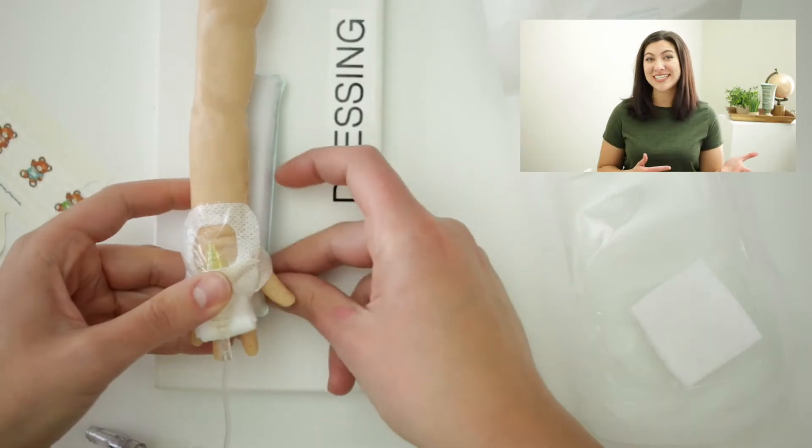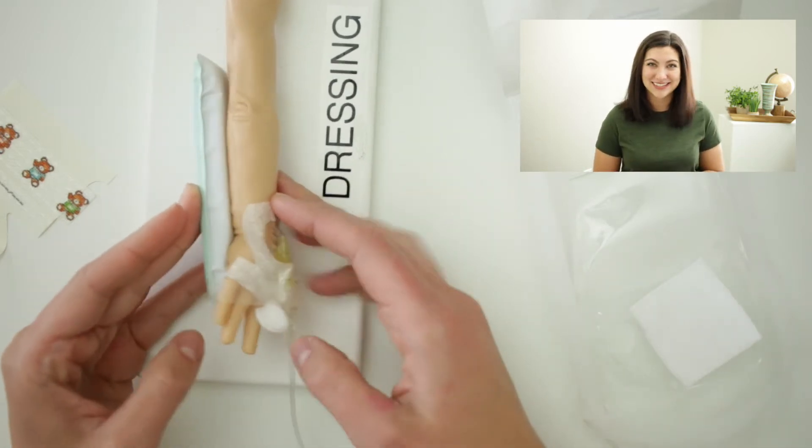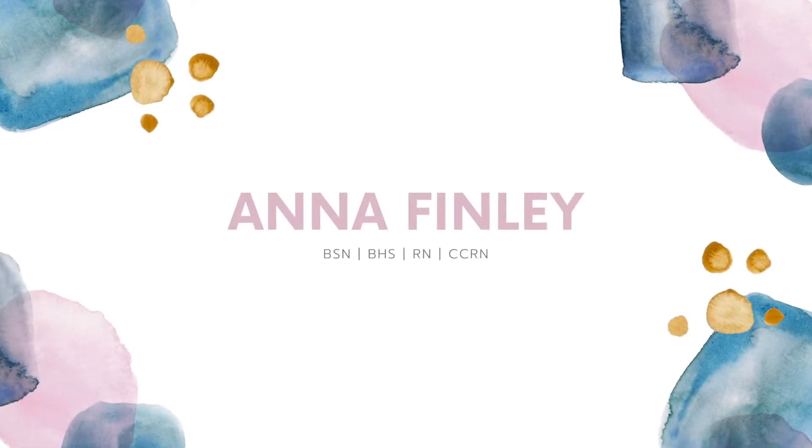This fantastic hand was specifically designed for new NICU nurses to practice taping on before they place IVs and tape IVs on real patients. My name is Anna and I am a critical care registered nurse. One of the questions I get asked at work a lot is how I tape peripheral IVs that I place. So today I thought I would do a video on how I tape a hand PIV placed in a neonate, using a fantastic model to demonstrate this taping on.